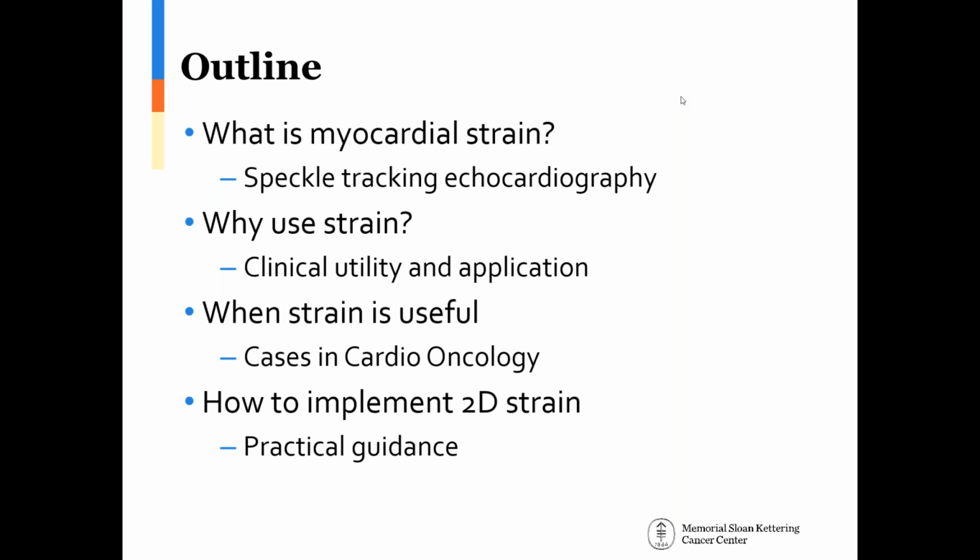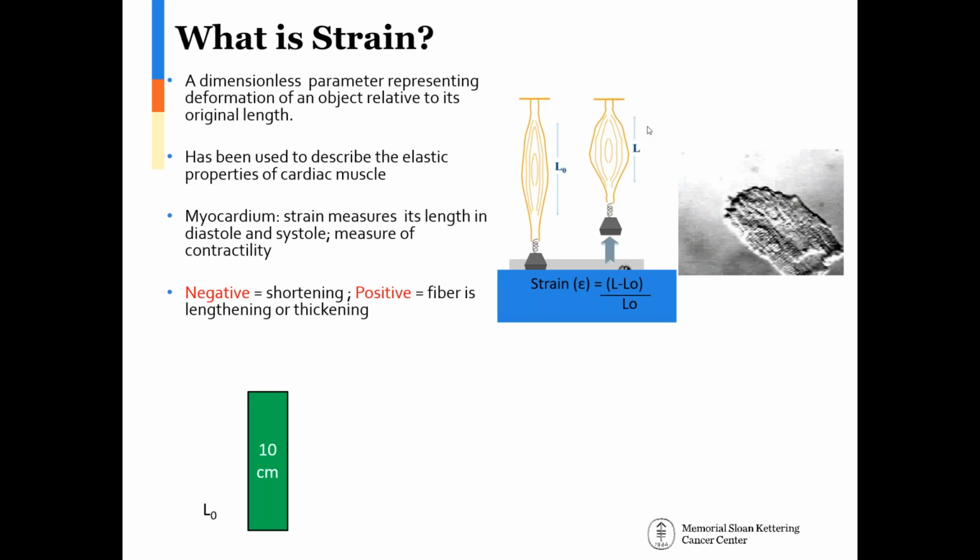In the next 20-25 minutes, I would like to provide an overview on myocardial strain and speckle tracking echocardiography briefly. I'd like to discuss the clinical utility and application of strain imaging and present several cases to demonstrate the utility of strain in cardio-oncology. And then end with some practical guidance on how to implement 2D strain in clinical practice.